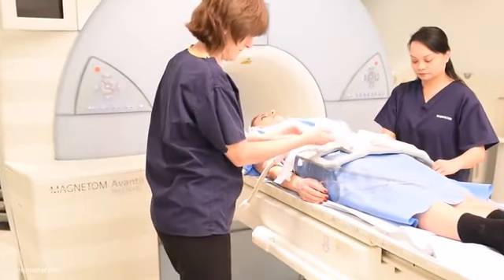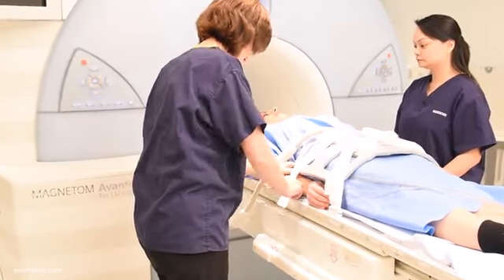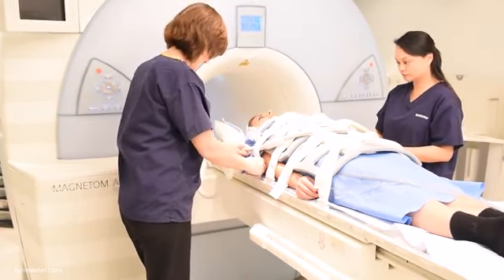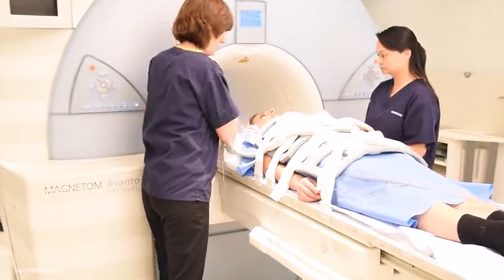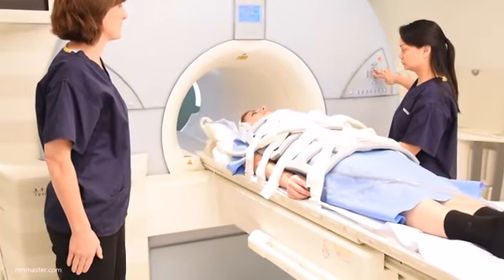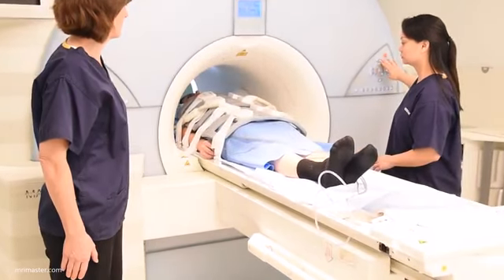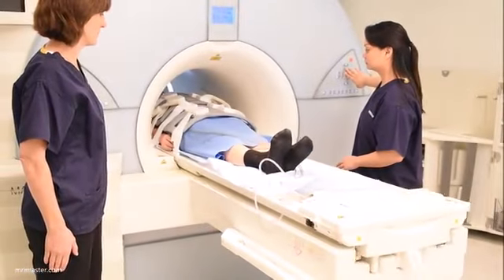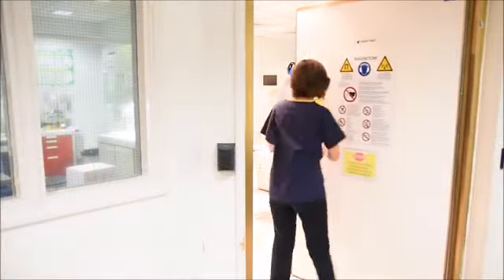Place a body coil over the patient's pelvis and another one over the abdomen. Slowly move the patient into the scanner and center 2 inches or 5 centimeters below the iliac crest, over the anterior superior iliac spine. Now fully move the patient into the scanner. Ensure they're calm and comfortable before leaving the room.